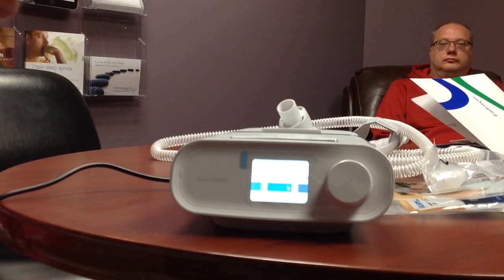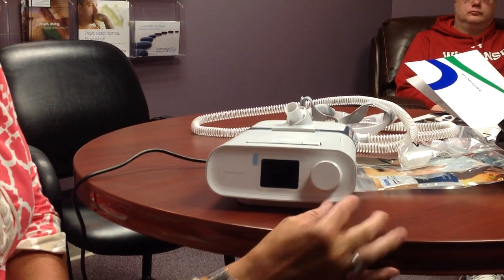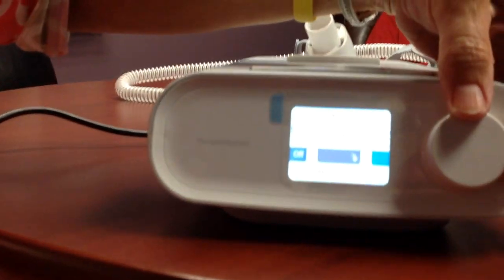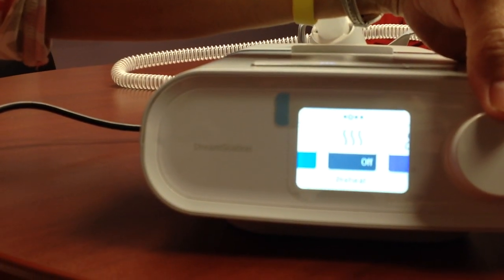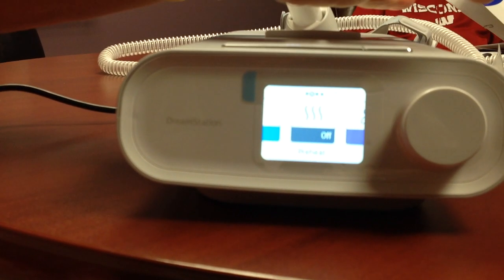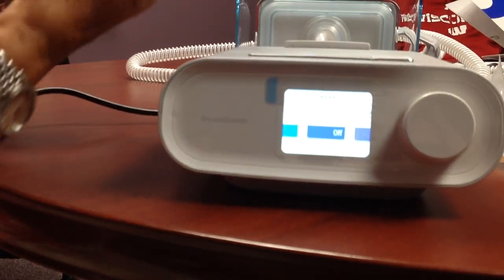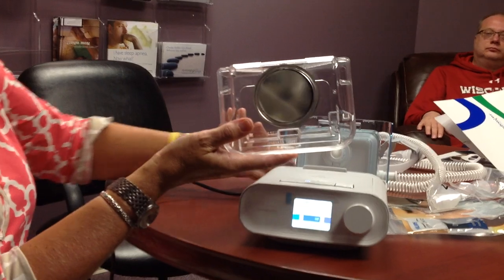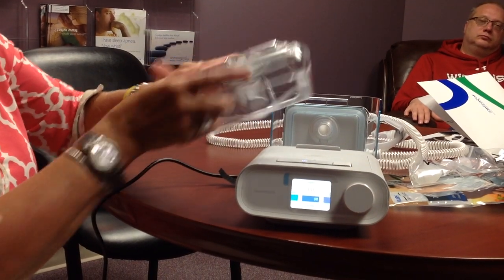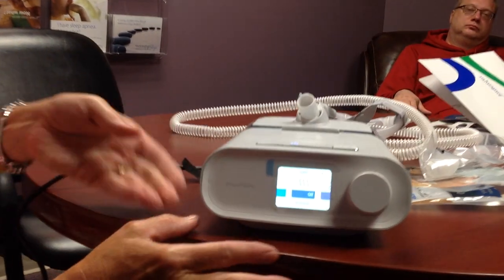Now we can go through the operation of the machine menus. When the machine is off, this dial is going to control going into your apps or menus. Preheat — you're usually not going to use this. The machine heats up well enough quickly that you really don't need to use it; we keep it off. There is a heating plate inside that does get warm, so in the morning you don't want to go sticking your fingers in there.